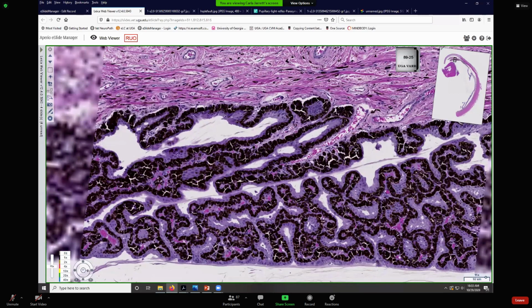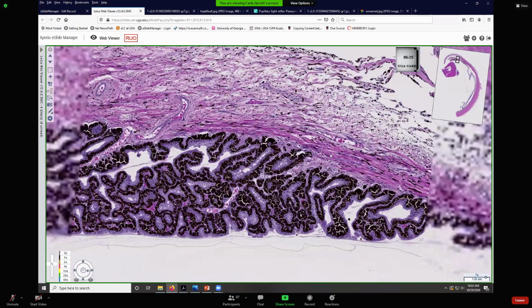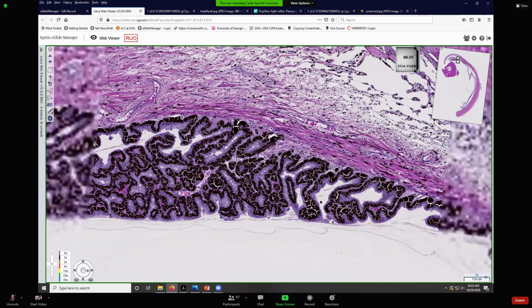Now that ciliary muscle is under parasympathetic innervation. So it'll contract for accommodation under parasympathetic control.